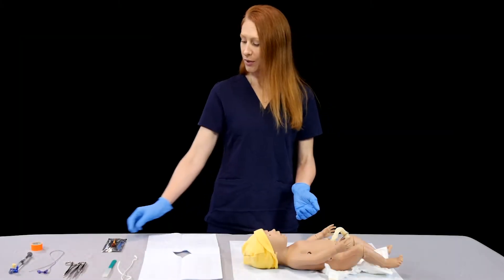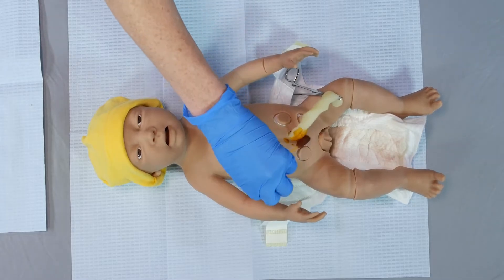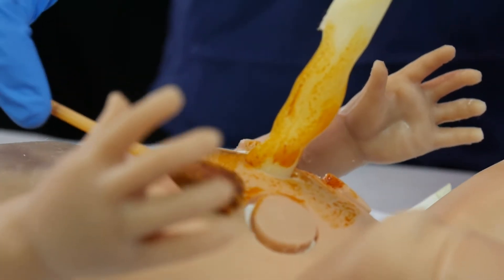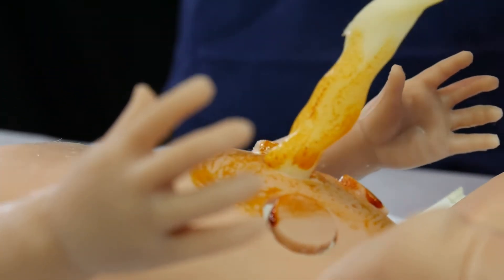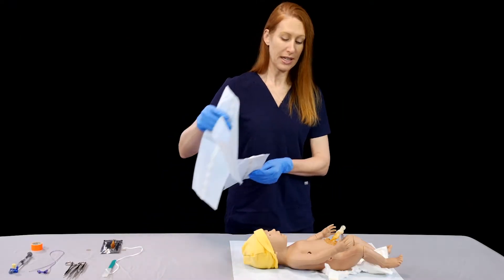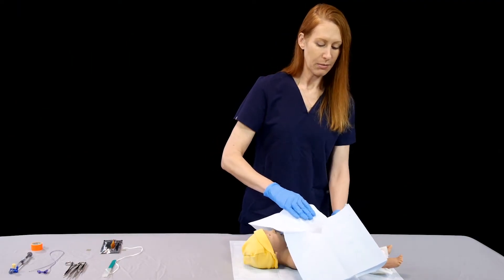The first thing we're going to do is clean the umbilical cord and the surrounding skin. Next, we're going to need some type of a sterile drape or sterile towels to put around the umbilicus.